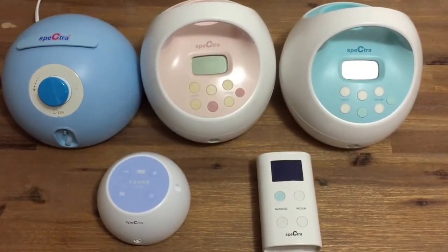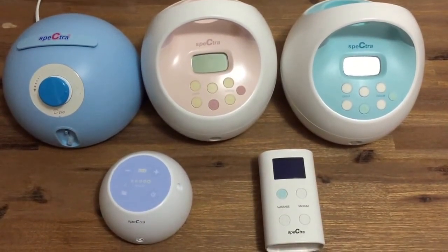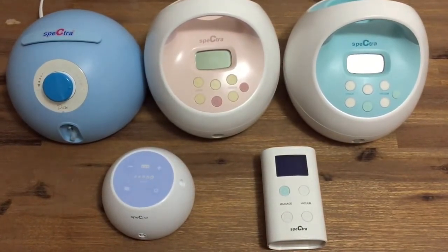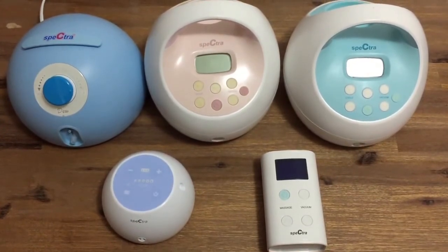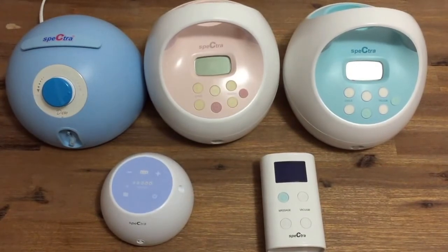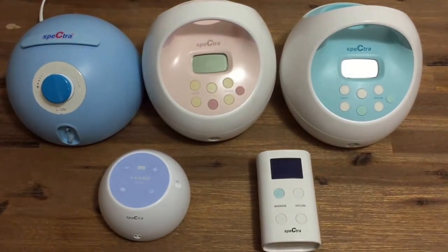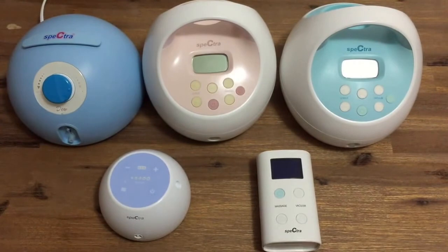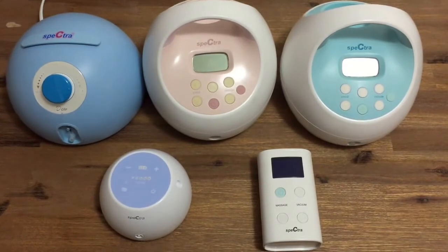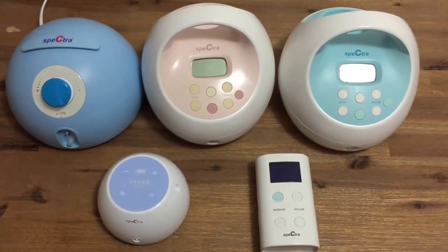Spectra Baby Australia offers a generous two year warranty on all pump motors and a limited six month warranty on parts for all products purchased from us on our website. This does not include wear and tear on your accessories. It's really important that you purchase your pump directly from Spectra Baby Australia or from one of our authorised channels, as we do not offer any warranty support for purchases made from an unauthorised or overseas retailer. We also supply a 30 day money back guarantee so long as your product is in a saleable condition, conditional on the pump being unused and unopened. For further information please go to spectra-baby.com.au/our-policies.